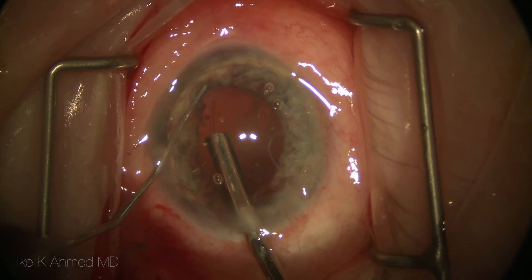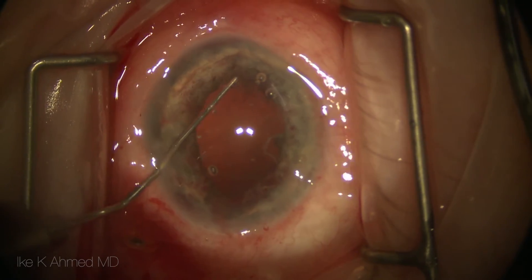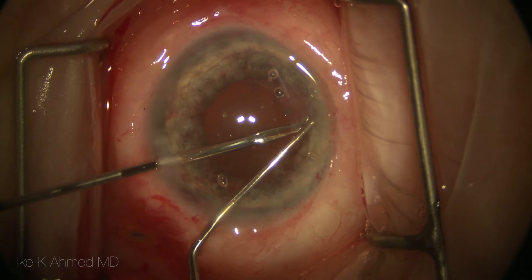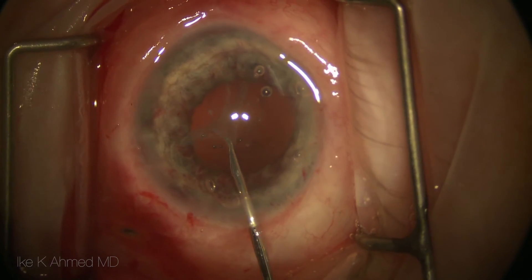Here a capsular tension ring (CTR) is being injected. The zonules are somewhat weak and the manipulations can certainly weaken things further, so the CTR will act for hopefully long-term stabilization. We put the CTR in after the in-the-bag lens has been removed and the Soemmering's rings have been removed.